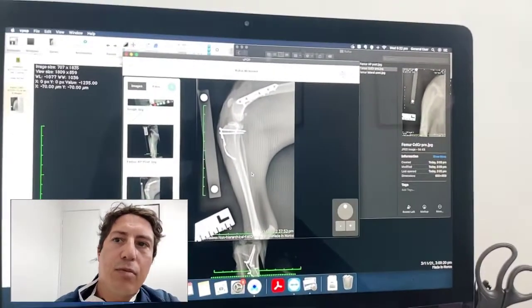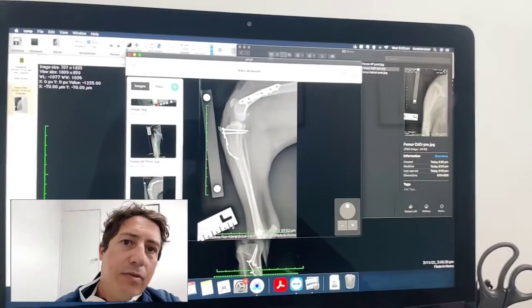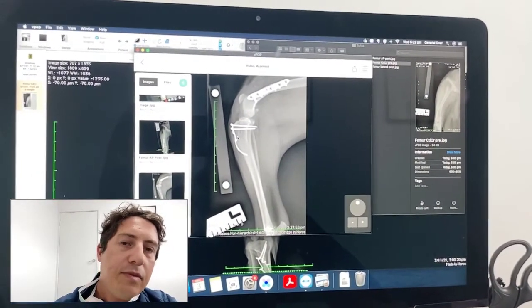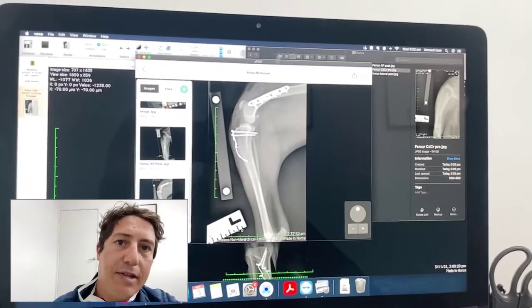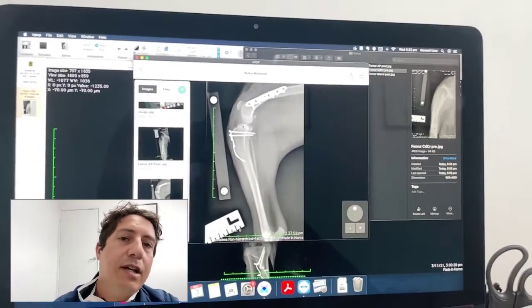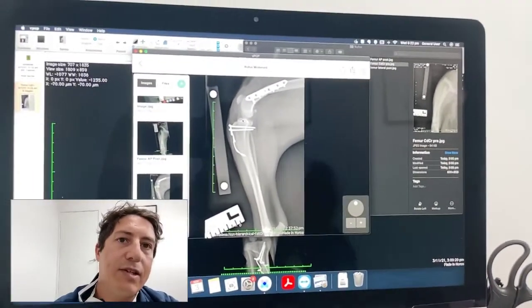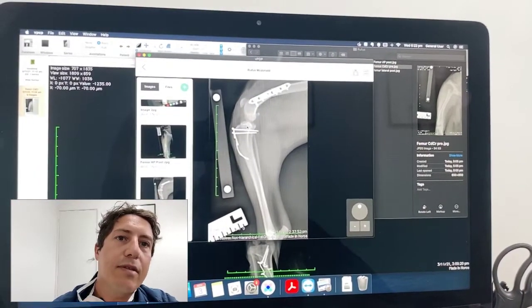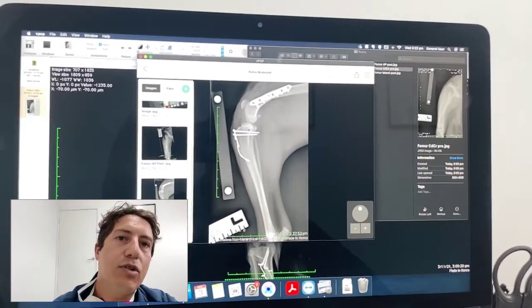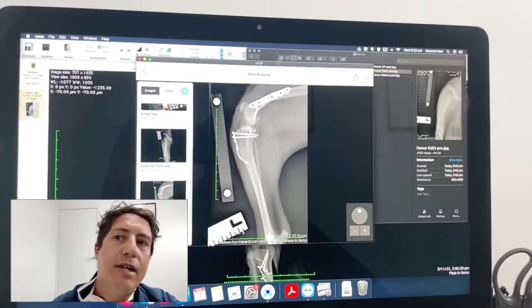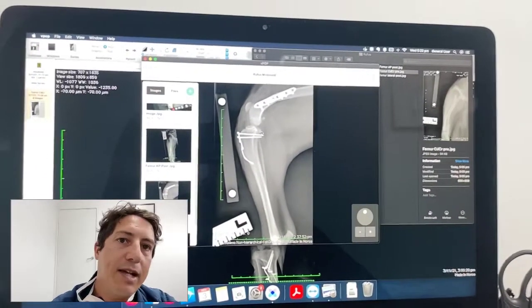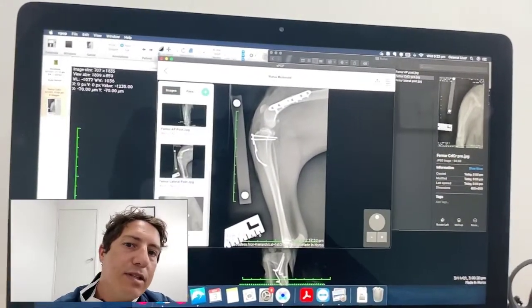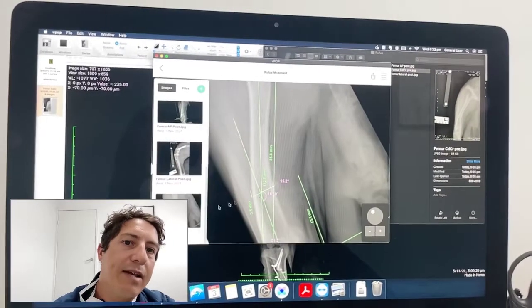Looking at the lateral view post-operatively, we can see our plate here. We also had to do a tibial crest transposition for this particular case to get that patellar tracking nicely. We did have to do quite a large medial release on the medial connective tissue and medial fascia, and once we've done that the patella is tracking normally and it's totally solid afterwards.